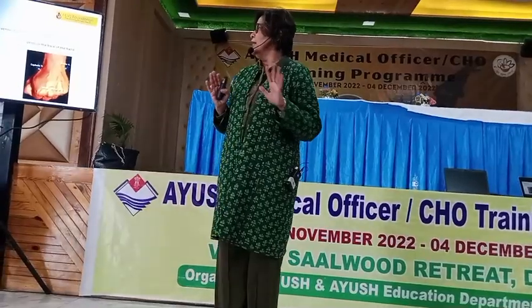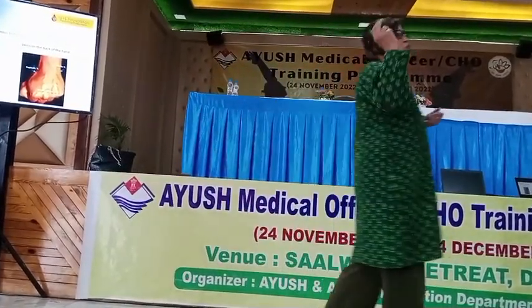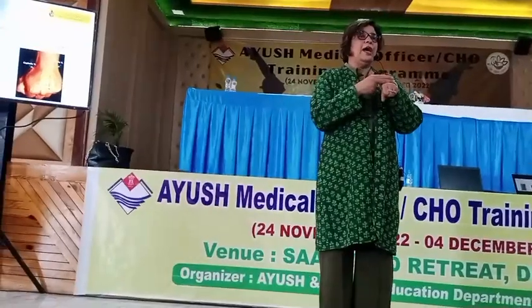Mostly from here the vein comes, and a good flow comes. So generally we approach the median cubital vein. And in case not, the dorsum of the hand.